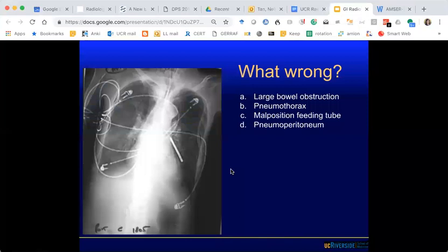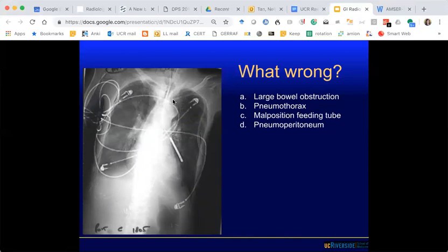What is wrong with this image? This is a scanogram — an image acquired right before CT. You look at the lines and tubes just like you would with a standard radiograph. Any guesses? Pneumothorax, or maybe a malpositioned feeding tube? Which side is the abnormality — right or left? So we see this line here, and then there's another catheter — probably a permacath because it's dual lumen, coming down the subclavian into the right SVC, correct place. Then we see this line coming down along the left.